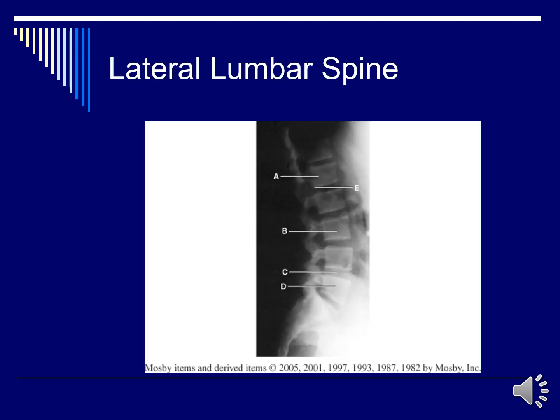This lateral lumbar spine, I want you to stop and look at this radiograph. We're best identifying the intervertebral foramen, the bodies, the intervertebral disc space, and the spinous process. So please take a moment to stop and look at your letters A through E.